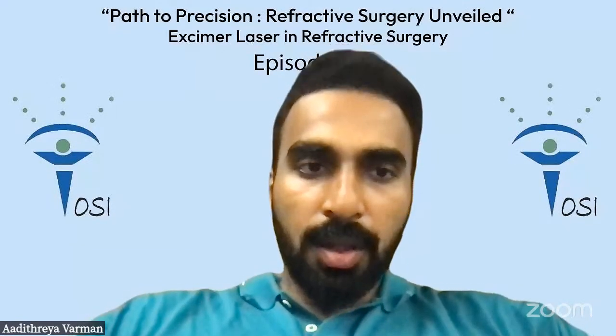Right. But as I said, it's not just to choose the procedure, it also helps you decide what the outcomes are going to be, especially when you are doing a lot of lenticule procedures. It will help you to tell what the quality of vision is going to be on day one. Is it going to take a longer time? Is it going to be a good quality of vision on day one? So it helps you to educate your patients, or to modulate your energies or your intraoperative techniques.